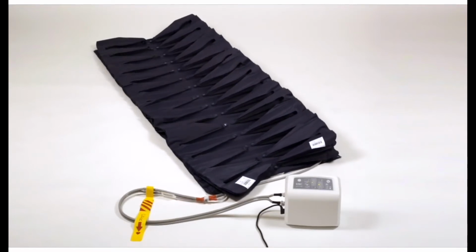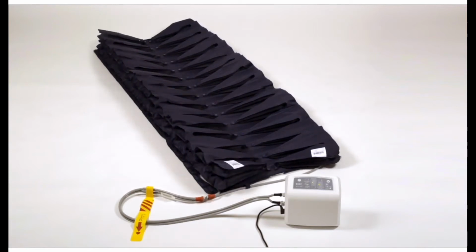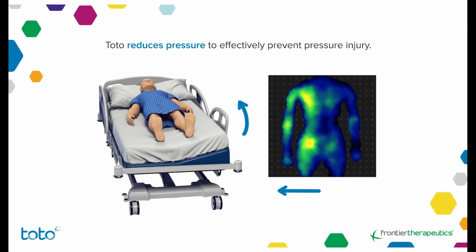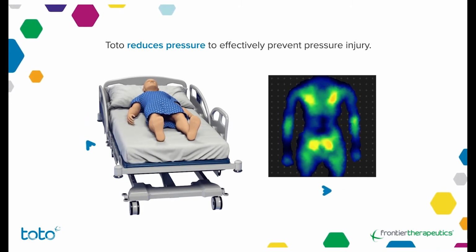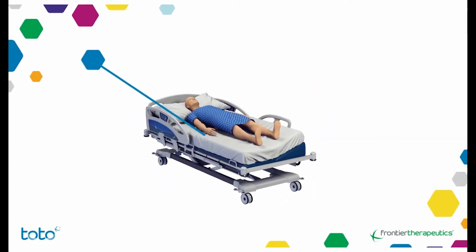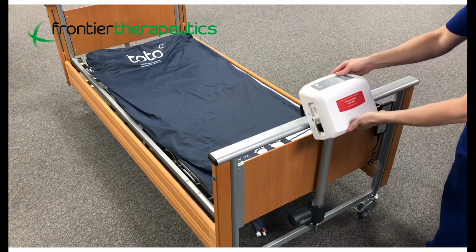Correct. So with the Toto device, it's actually an inflatable platform that goes on the bed frame underneath the mattress, and one side will completely inflate and lift both the mattress and the patient to a full 30-degree angle, and you can set it for intervals between 30 minutes, 1 hour, 2 hours, 3 hours, and 4 hours.